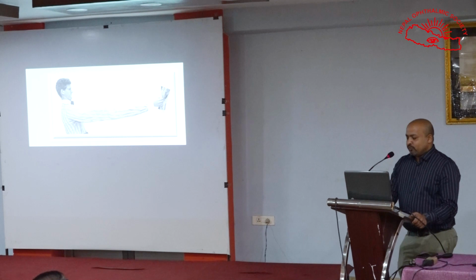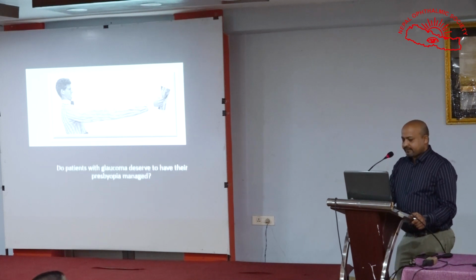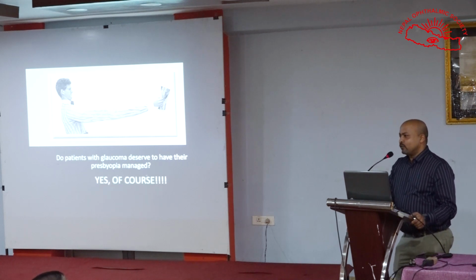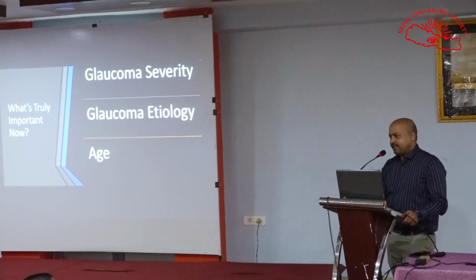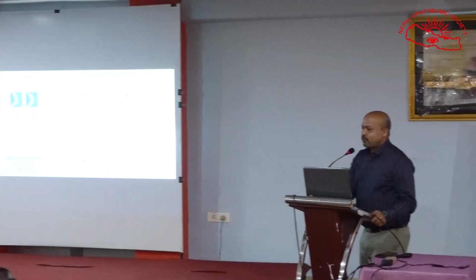Then the most commonly asked question by patients today is, do patients with glaucoma deserve to have their presbyopia managed? The answer is yes, of course. It depends upon the stage of disease at which the patient comes to you, as well as the severity of the disease, the etiology of the disease, and the age of the patient. So this is a guided progression analysis. It shows that the patient has a stable glaucoma, early glaucoma.